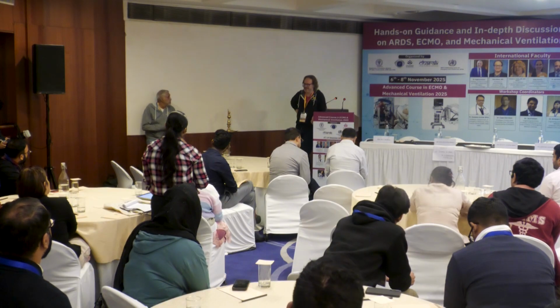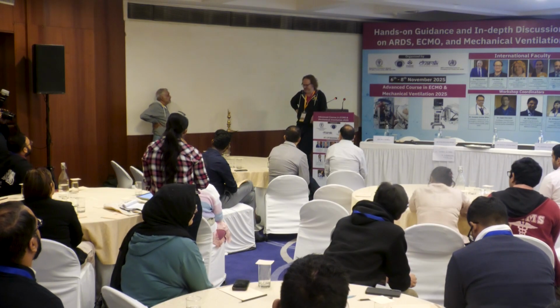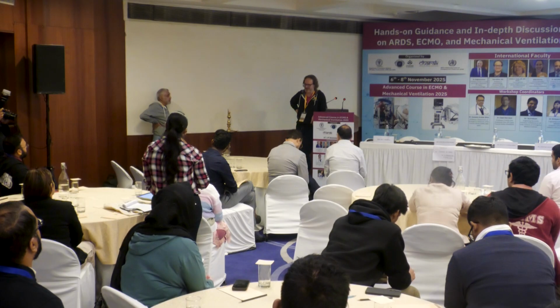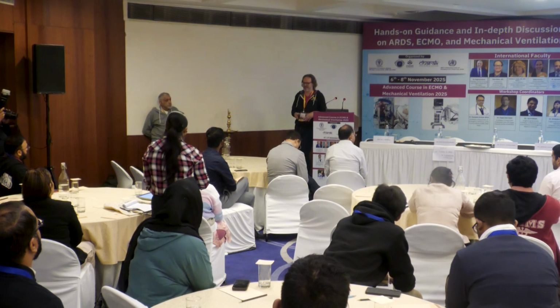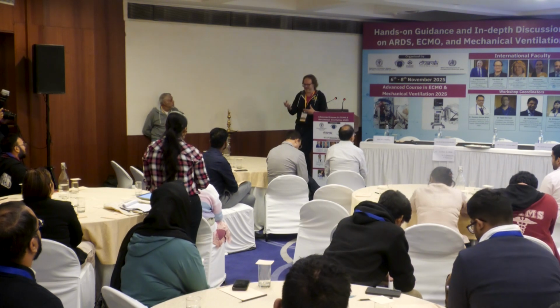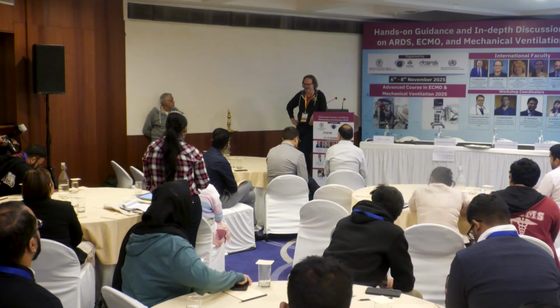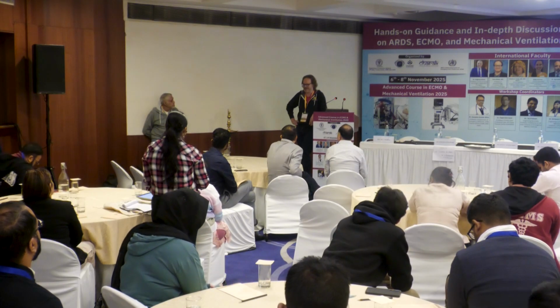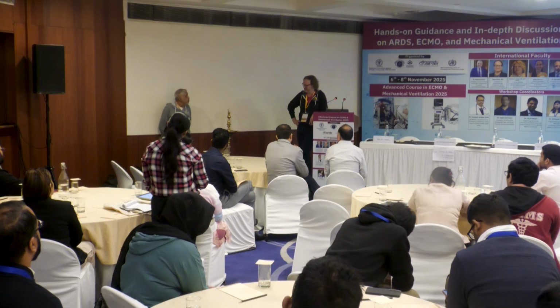Yeah, he is a surgeon who was at Michigan and was at University of Maryland for several years. I think he helped run their ECMO program, did many cases, and has now more recently come back to Michigan. So he has a lot of experience. I think, yes, if you have the team, it's not just the cannulator, it's the cannulator and the ICU team working together, it can be done, but I think fluoroscopy is more established for positioning. And TEE too, we do both.